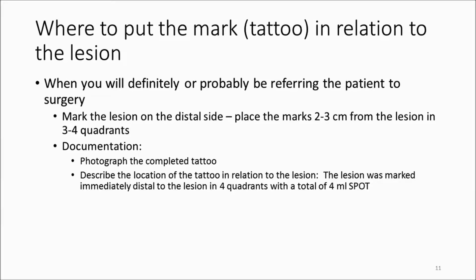Document by photographing the completed tattoo, which usually will show the lesion immediately proximal to the tattoo, and state in the report where you put it. For example: 'This lesion was marked immediately distally in four quadrants with a total of 4 mL of Spot.'